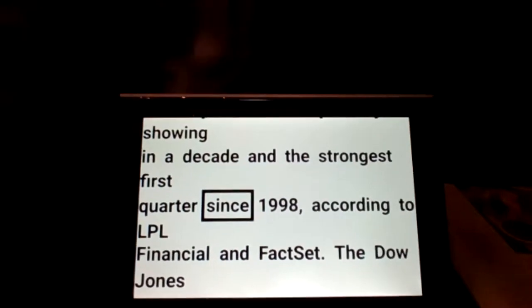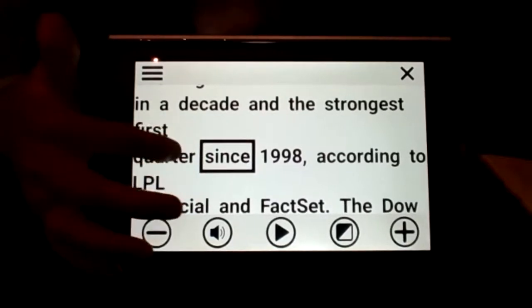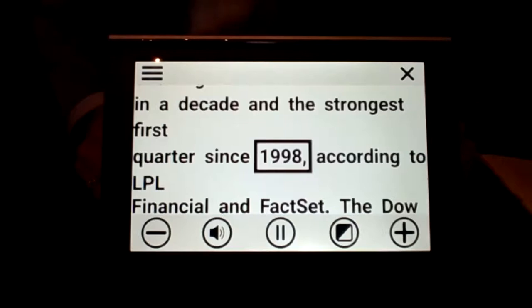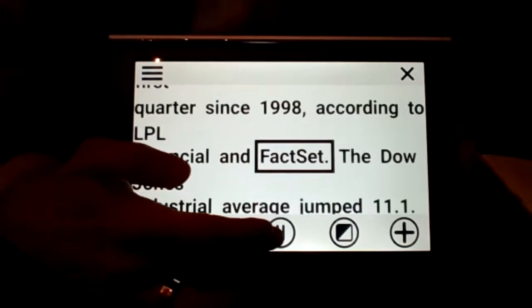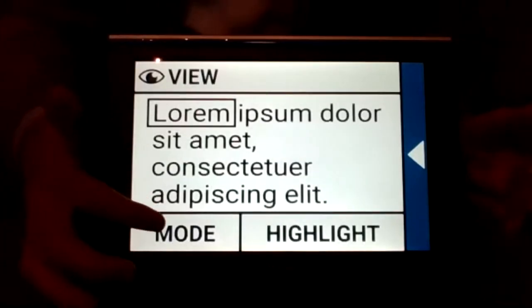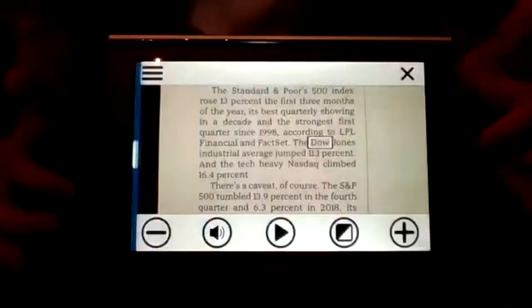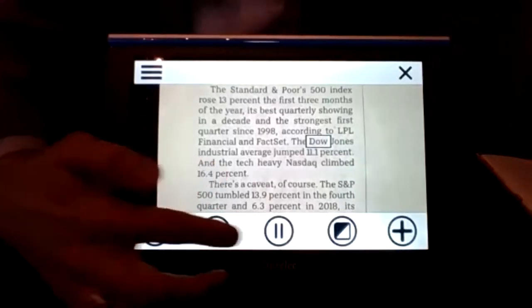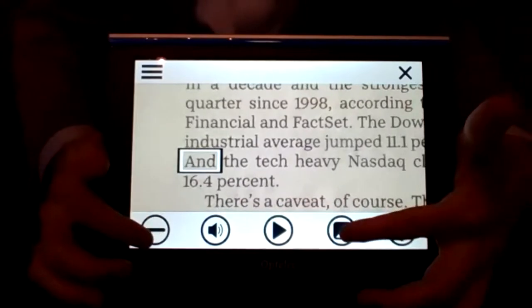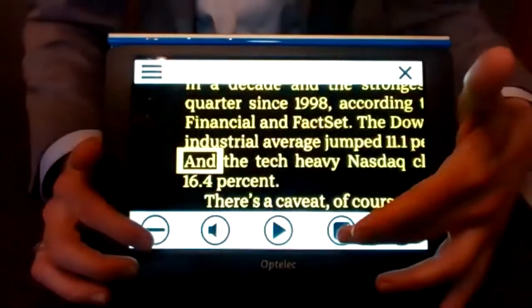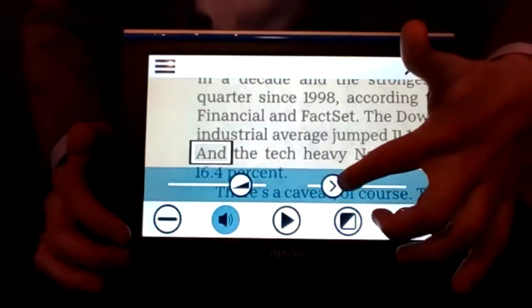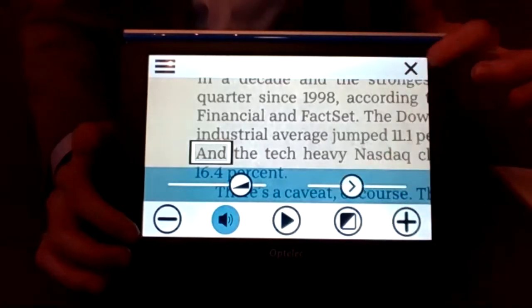I just wanted to show one more thing: the OCR mode. I have a newspaper article that was scanned. If I click play — 'Since 1998, according to LPL Financial and FactSet' — you can see how it reads for you quickly. As Richard mentioned, if we go into settings and change the view, we can change to a different view mode. You can see that as a newspaper article scanned in, and it will read it while highlighting. You can still magnify, it will still spotlight the text, change highlighting, and change the speed of speech. You can tap the speaker button to increase or decrease the volume and the voice speed.